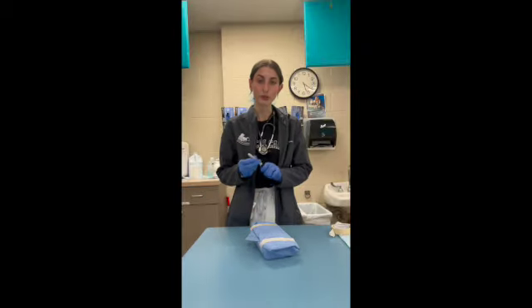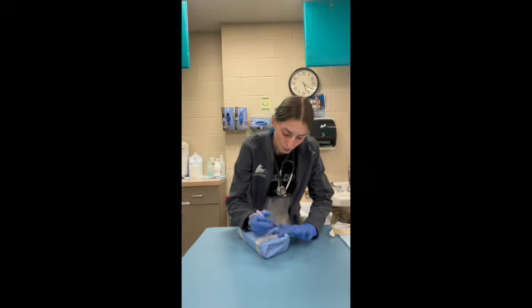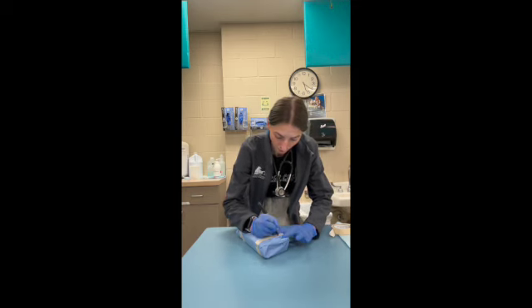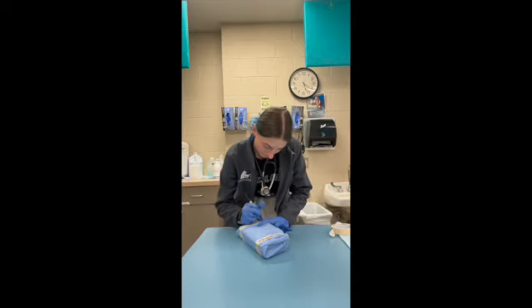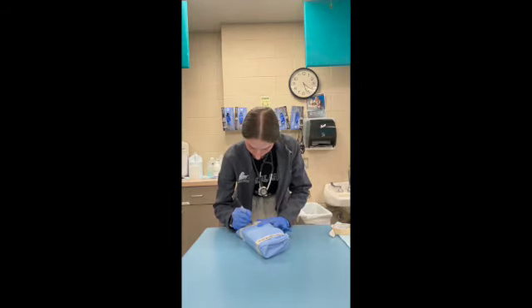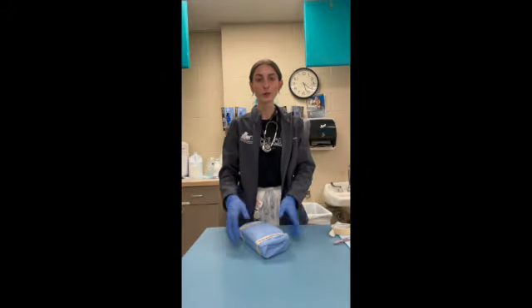Alrighty, and so now we will just date and time this and label what pack it is. So this is our small wound pack. Alrighty, and so now we will take this and put it in our autoclave.